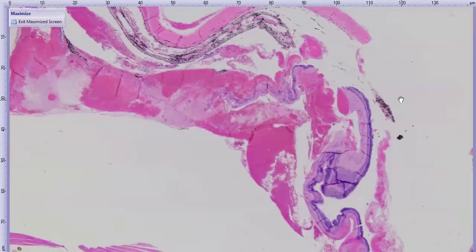However, I should also say, you can get retinal detachment when you have an iatrogenic laceration of the sclera during an enucleation surgery. However, what shouldn't happen is the retina completely losing all of its architecture right here. So this is a true lesion. So this is what a detached retina that can be iatrogenically detached would look like, where you have very nice definition of all the retinal layers. It's just that it's not attached to the choroid anymore.